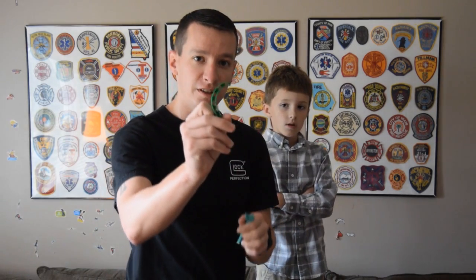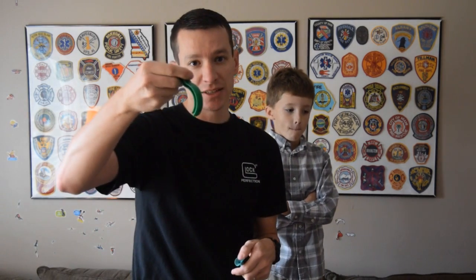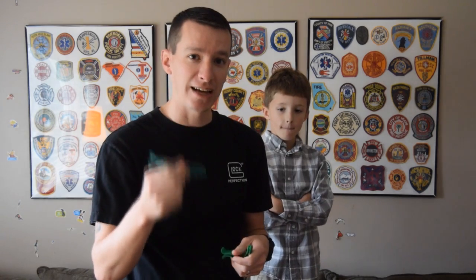In this video, I want to focus more on the gag reflex part of this, because this is a hard, rigid airway J-frame that goes into the patient's mouth, opens behind the tongue, and opens the airway. This is for someone obviously who cannot protect their own airway. This other device goes into the nose and will typically bypass the gag reflex.